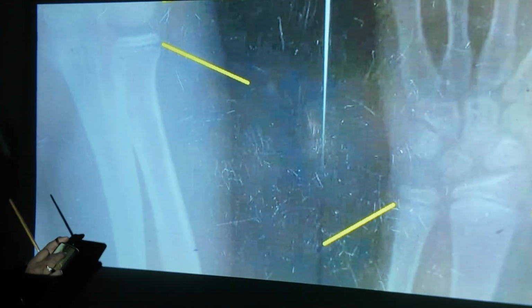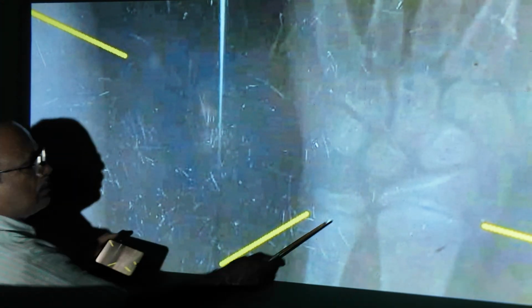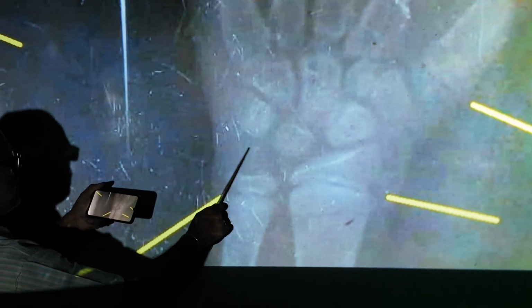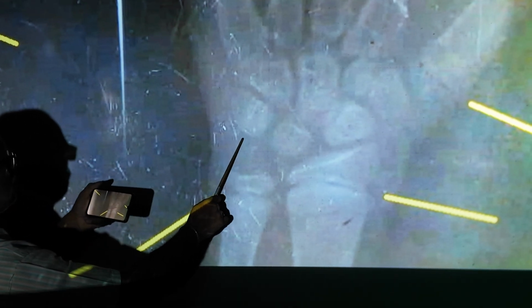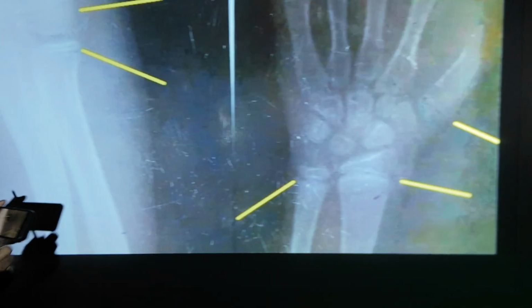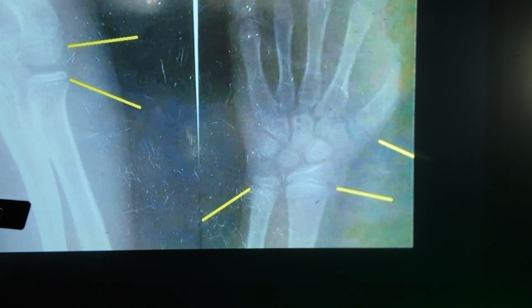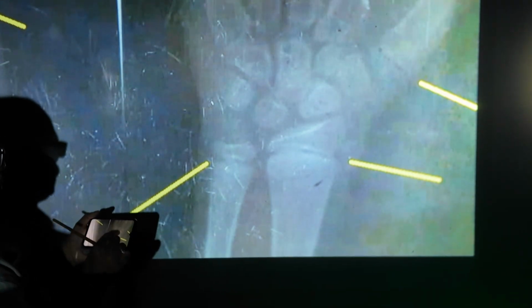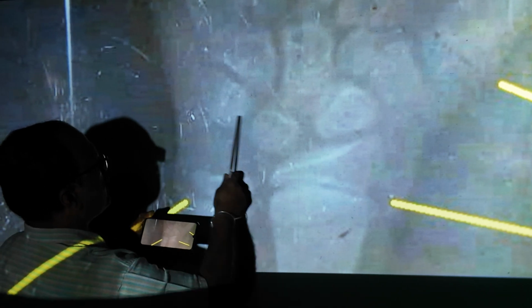You can see the lower end of the ulna, lower end of the radius, styloid process, pisiform bone. You can see here, pisiform bone is not seen. So we can say that by 12 years, not yet. Pisiform bone not yet appeared, age less than 12 years.